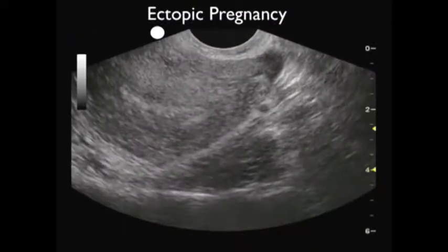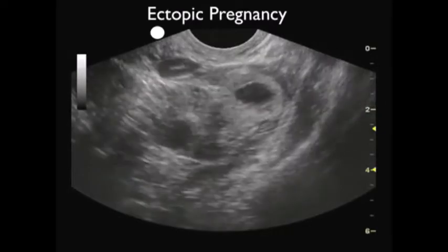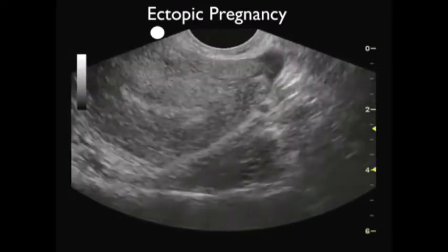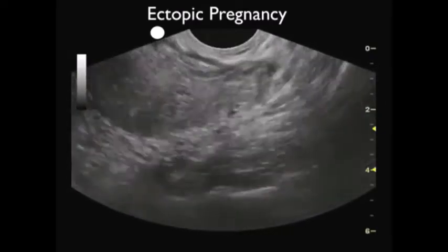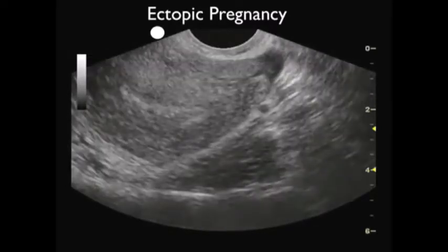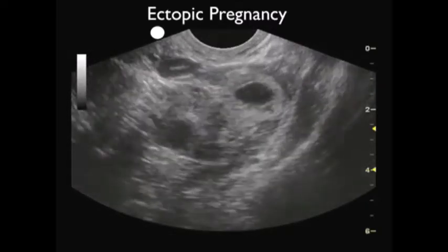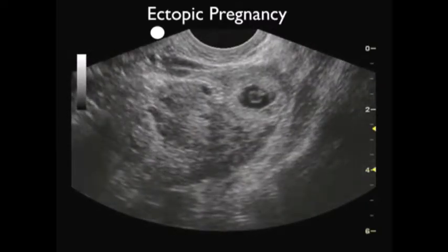Here's another version of an ectopic pregnancy. Again, we're scanning from the midline uterus, and we fail to appreciate any intrauterine pregnancy. And as we scan out towards the left adnexa, we see a positive finding right there. We notice a thickened fallopian tube with contents inside. So go ahead and still down that image.